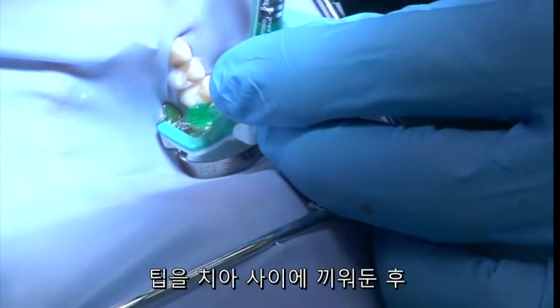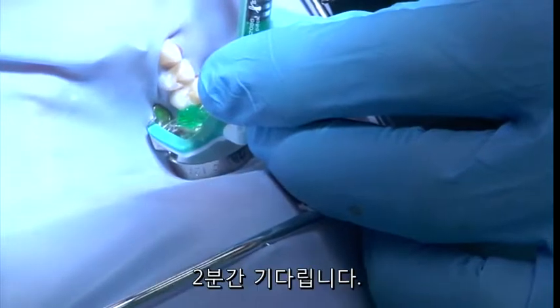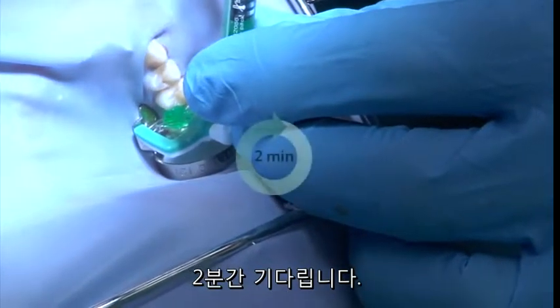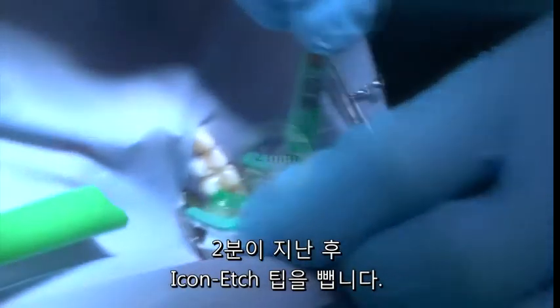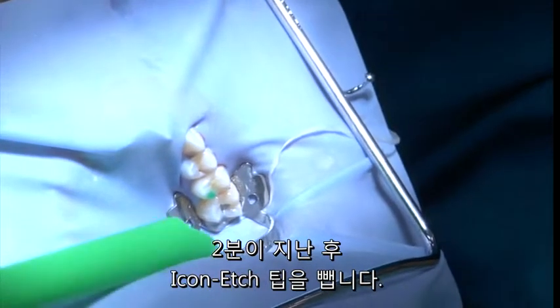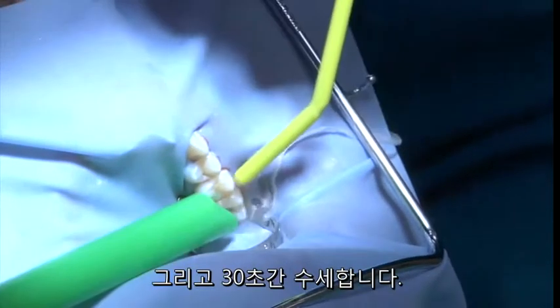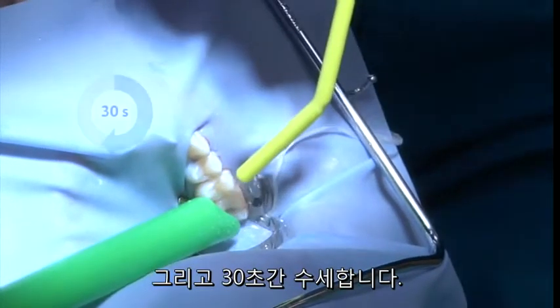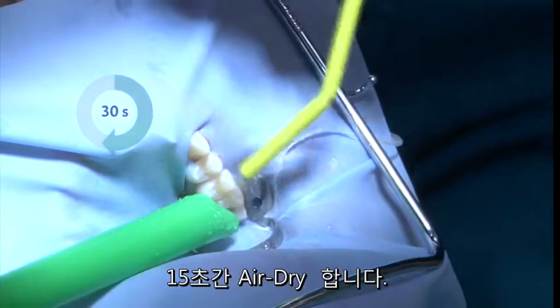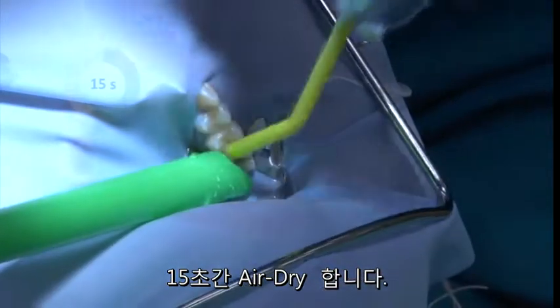With the applicator tip in place, allow the etchant to sit for two minutes. After two minutes, the proximal tip is removed and the tooth is rinsed for 30 seconds with water. Then thoroughly dry with oil-free and water-free air for 15 seconds.